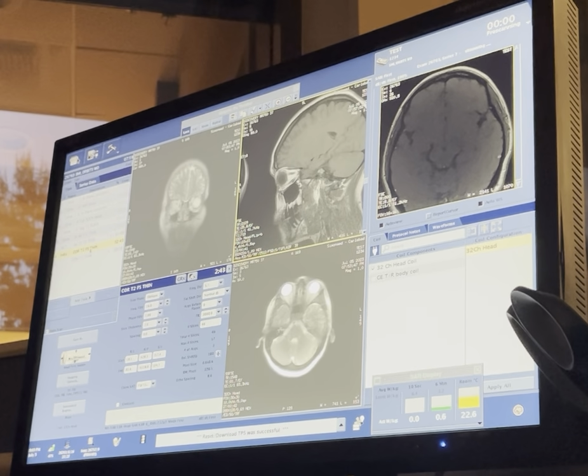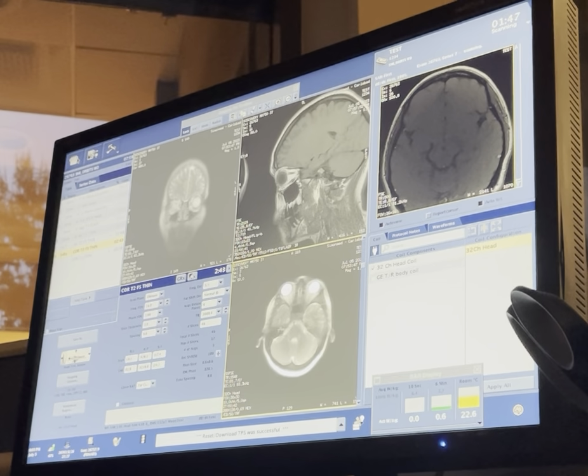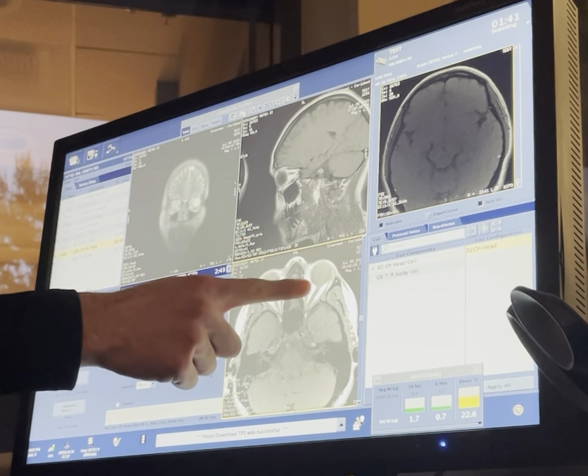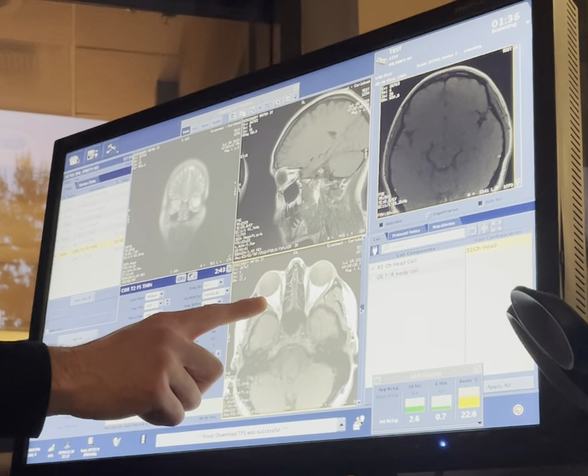So let's see, we have an axial, yeah, we have an axial, so let's middle click and bring up our new axial. Ooh, look at that. You see those now? Nice. So now scroll through, and let's see if we could follow them. Other way.